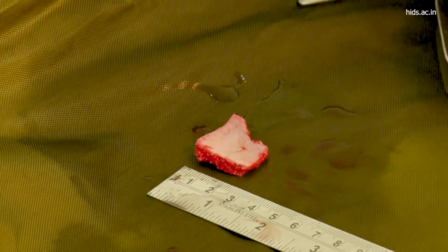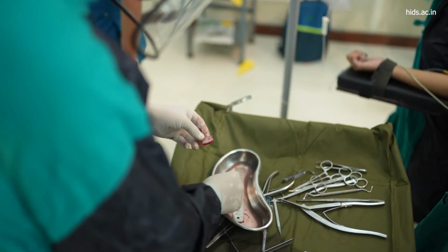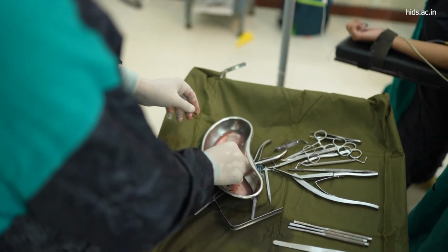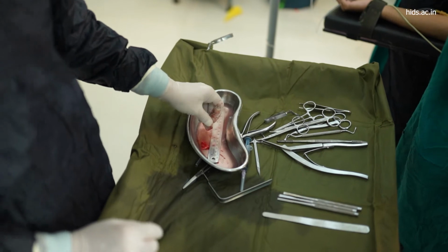This is the graft that we have taken. It consists of cortical plate and underlying cancellous bone. For storage purposes, we will immerse the graft in gauze soaked with saline. It should be dipped in the saline. It should never be left to dry.